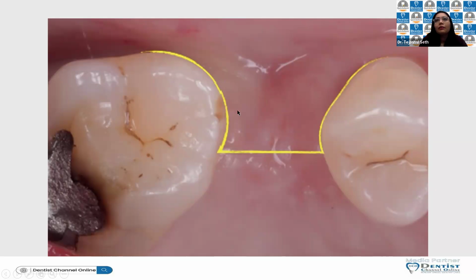Anytime you give a mid-crestal incision, you have to ask yourself whether you want to push the tissue a bit buccal, or how the ridge is over there, how the tissue adaptation is over there, and whether you're planning any augmentative procedures along with your implant placement.